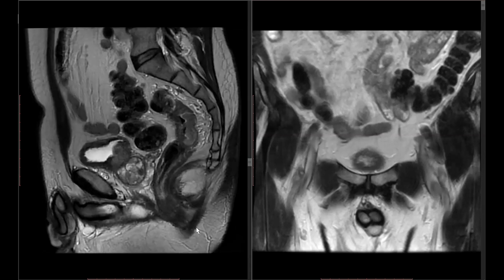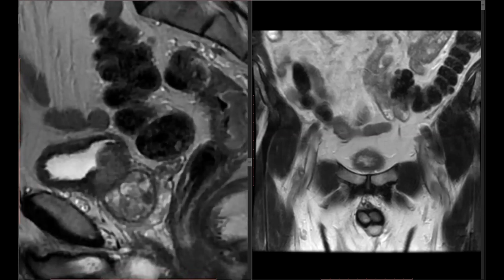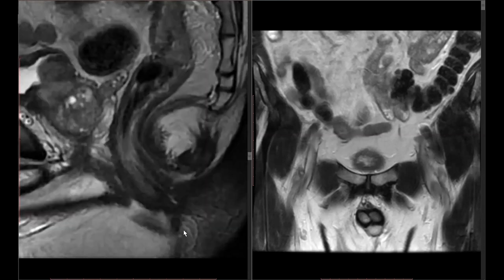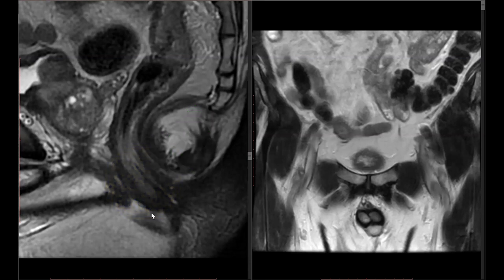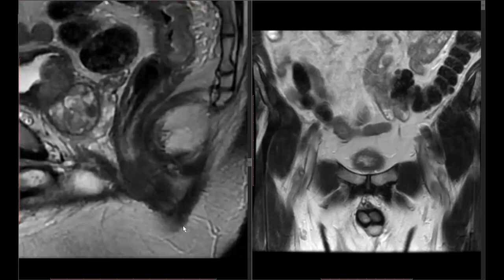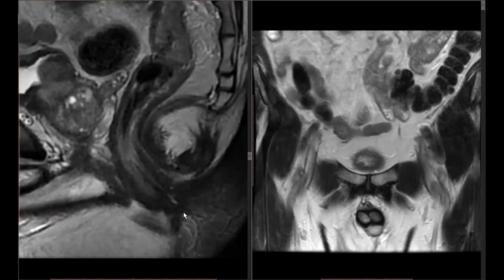That raises the next question: what constitutes the anal verge and how do you define it on MR? Looking at the sagittal weighted image, within the anal canal there are two structures. The slightly brighter inner structure is the internal sphincter, and surrounding it, the darker structure with the same signal intensity as skeletal muscle is the external sphincter. The external sphincter extends a little bit lower than the internal sphincter. Some institutions take the anal verge as where the external sphincter ends, and others take it as where the internal sphincter ends — a difference of only a few millimeters.